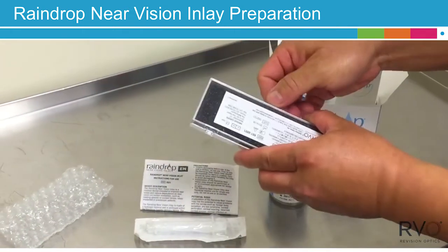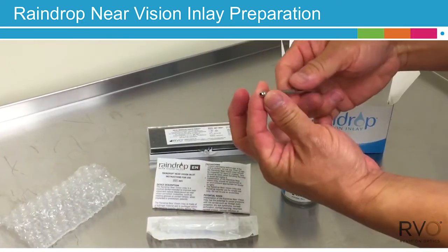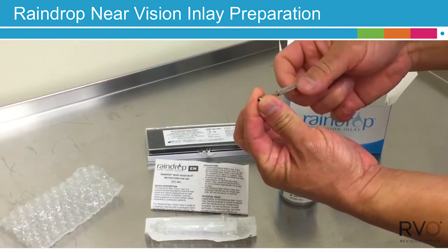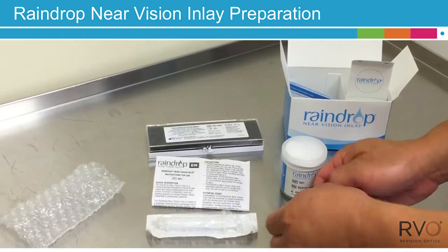The Inserter Chuck Handle has three components: the handle, the sleeve, and the chuck. The Inserter Chuck Handle comes unsterile and will need to be fully disassembled and sterilized prior to use.